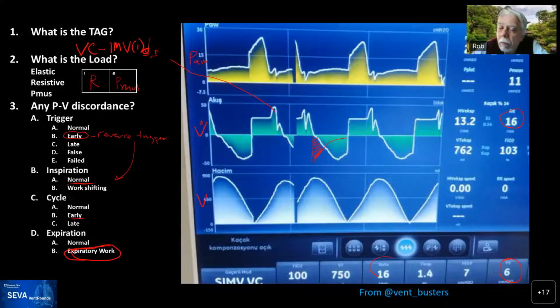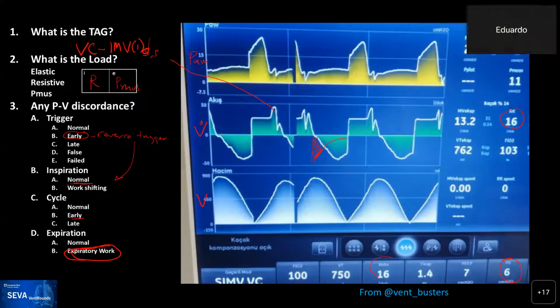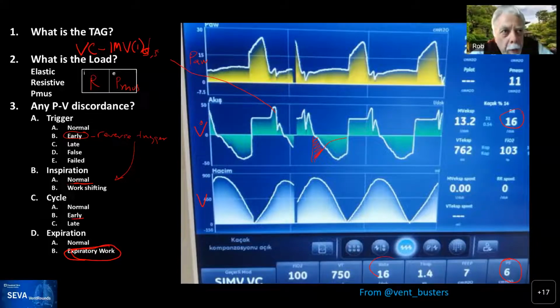Thank you, Rob. Which ventilator has pressure to volume? Can you comment on that? The most common one is the Draeger V500. You put it in volume control, and there's a setting called Pmax. So the volume will be delivered at the set rate, set inspiratory flow, until inspiratory pressure hits the Pmax. Yep.